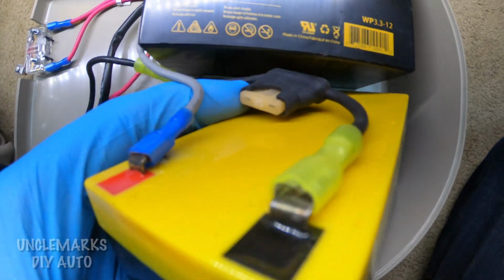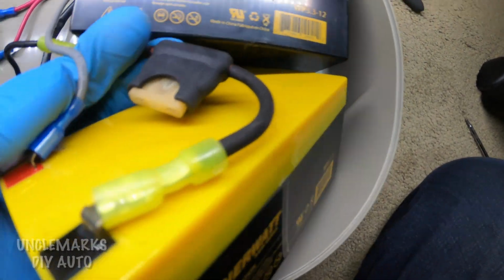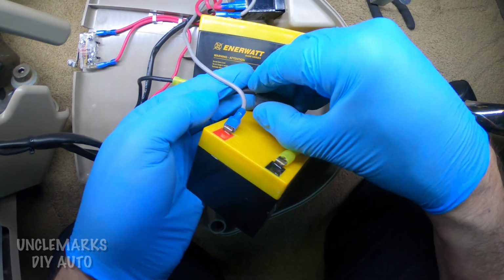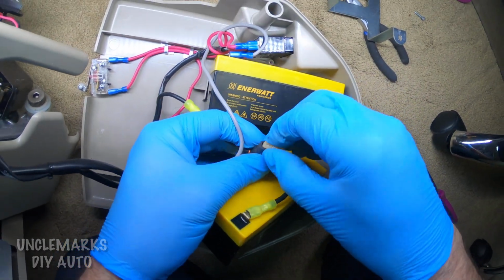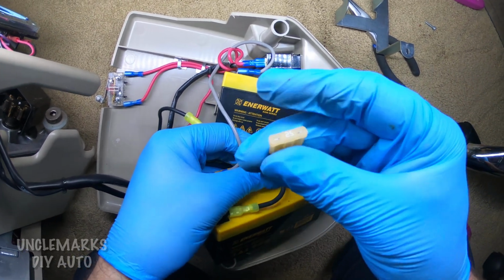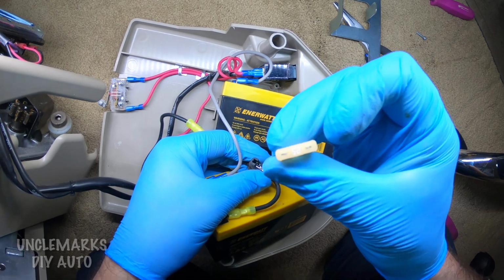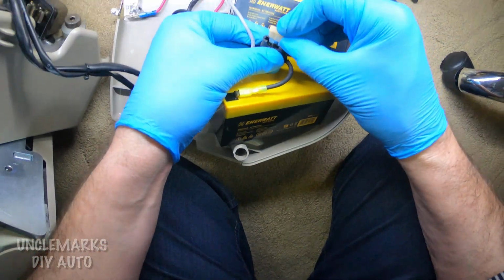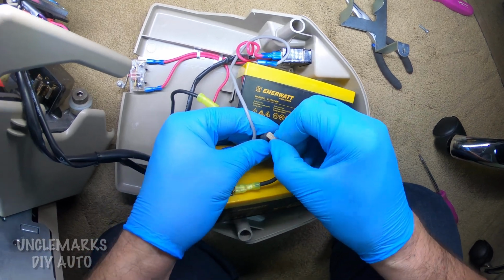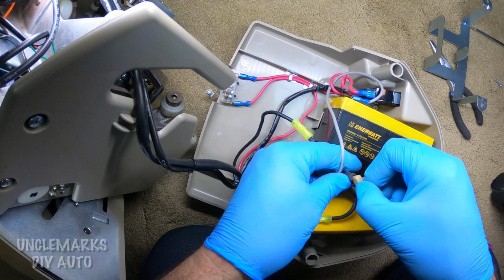There's actually, this one has another fuse right here. Looks like a 25 amp fuse. You may want to check that as well before you do anything with the batteries, maybe the fuse is gone. If it's gone, it won't be charging then, or maybe it's blown for another reason. So check that first. If the fuse was blown, put another one in. Then you could hook it back up and see if maybe that was your problem.